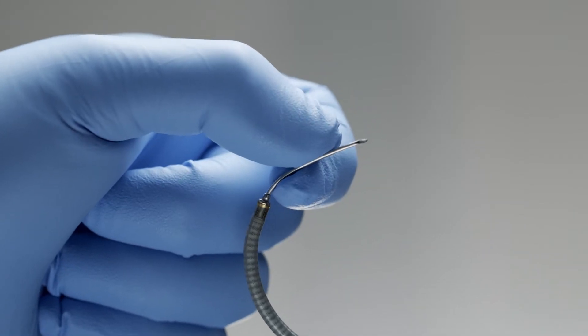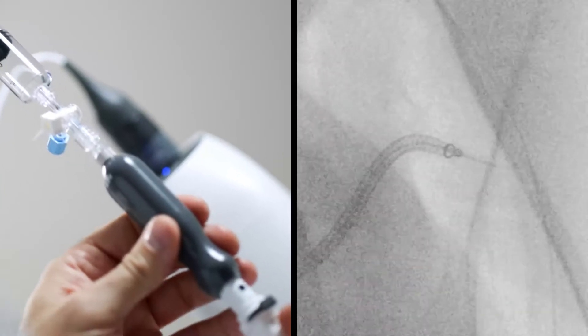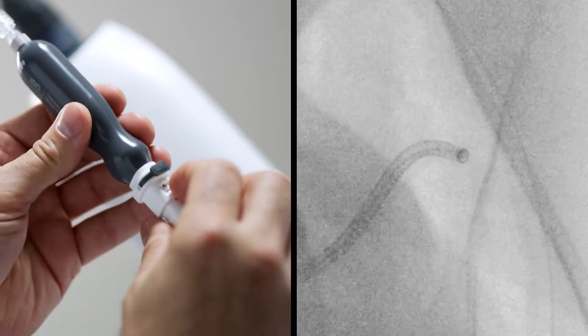Ion's Flexision biopsy needle is flexible and allows it to advance through tight catheter bends and still deploy on a straight path into the target location.